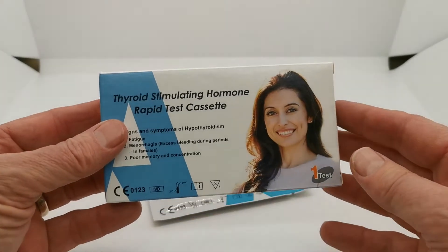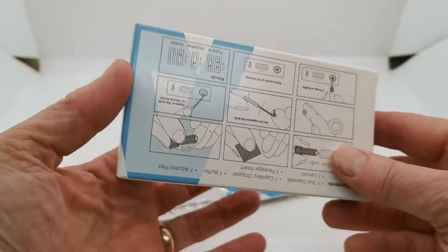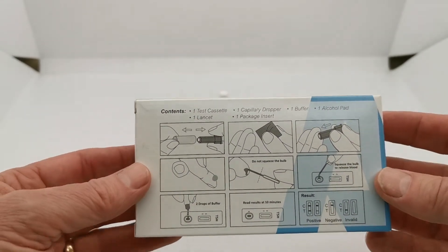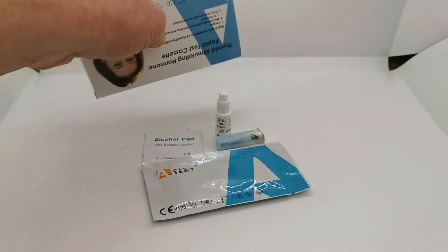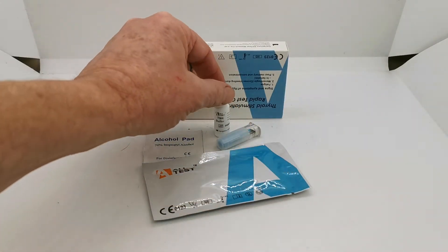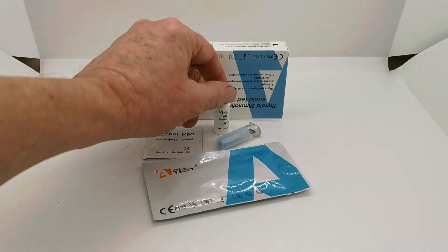Now the box pack — thyroid stimulating hormone — with simple instructions on the reverse. Basically what you get in this pack is an auto pre-loaded sprung lancing device for getting your blood sample, and an alcohol pad for wiping your finger clean before you do that.